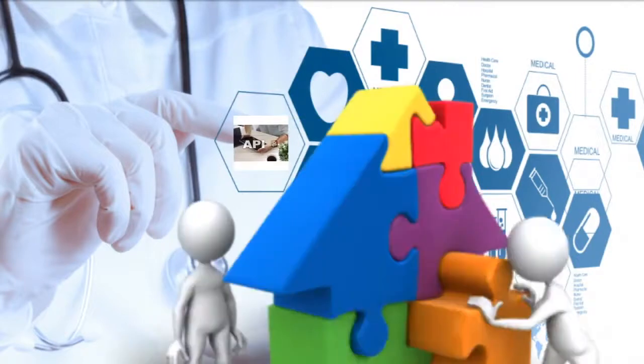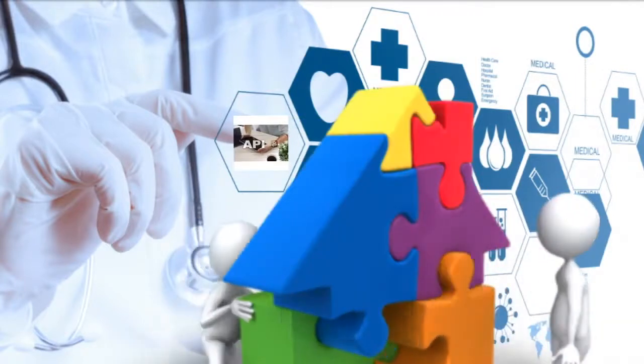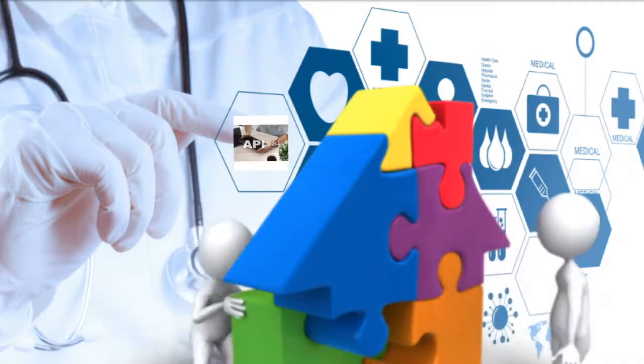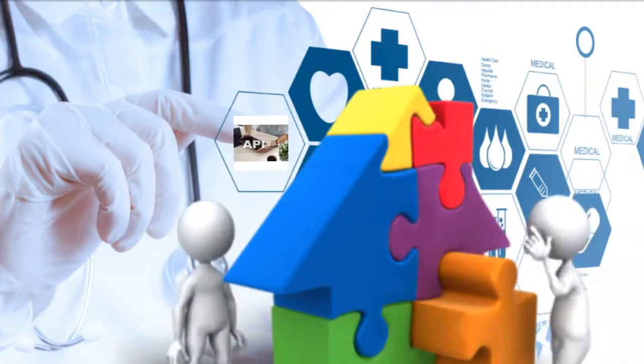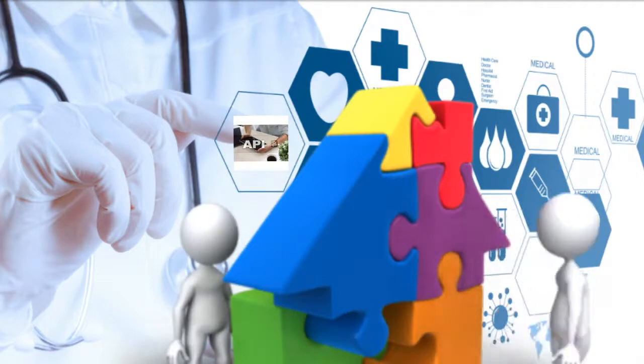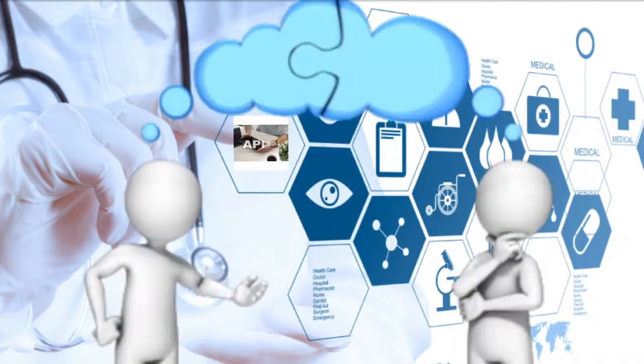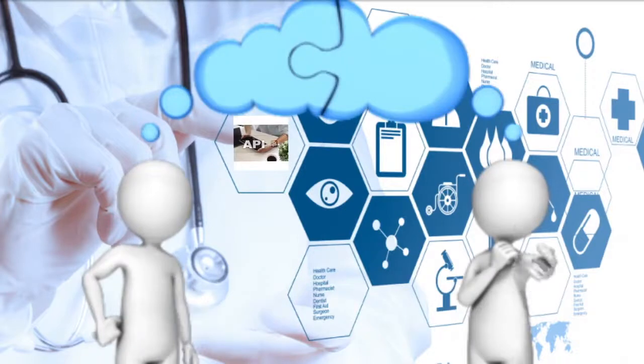Smarthealth1on1 offers public APIs enabling data to be pushed and pulled from our platform to others seamlessly. We understand the importance of the transfer of information, and there isn't any additional charge for this service. Every feature that has been shown to you in this pre-recorded webinar is attached to APIs, so if you can dream it, we can provide it to you.